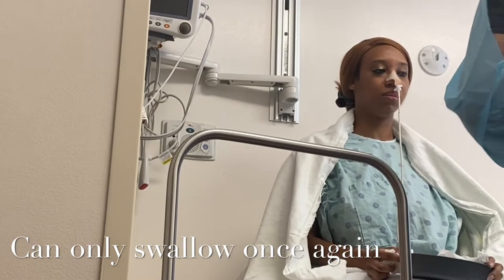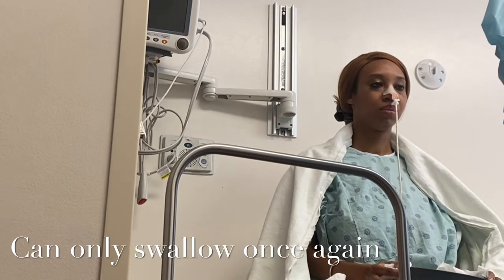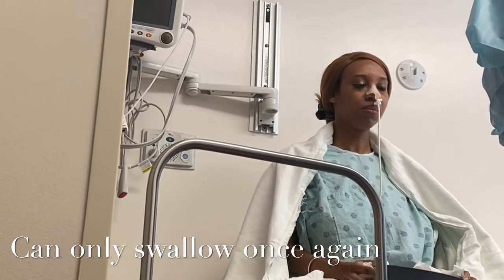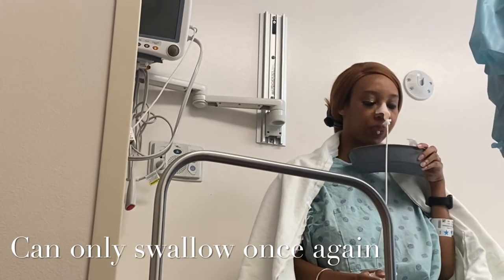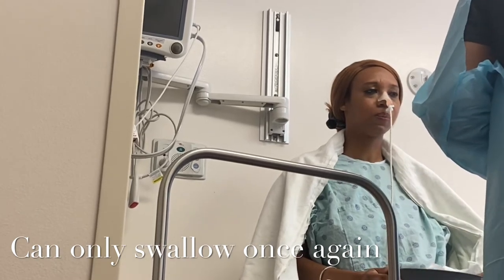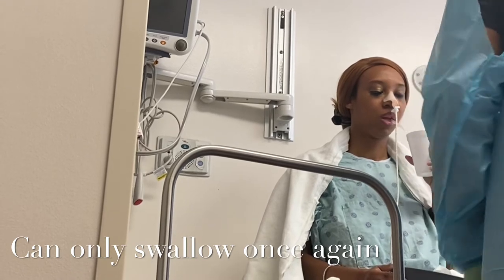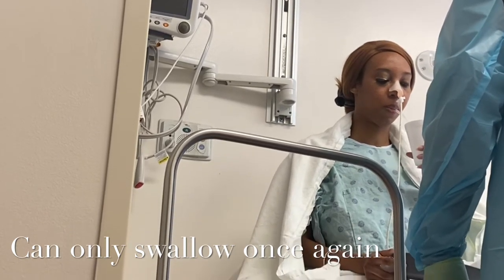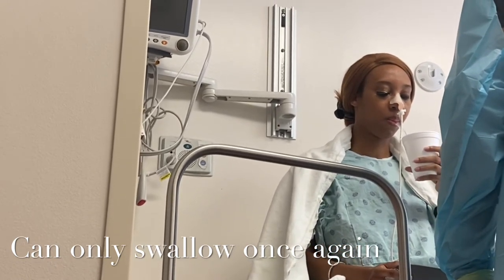Now this last part, you want to see how long it takes you to drink this 200 cc's, it's almost 7 ounces of water. Do your best, as fast as I can. Fast as you can, but safe. Safety first. I'm going to push when you start drinking it, and I'm going to push when you finish, okay? If you can't finish, you just write a note saying you can't do it. Hold on to it. Try to drink with your head down, and start when you're ready. Okay, I can start. There you go. Fast as you can, but safe.